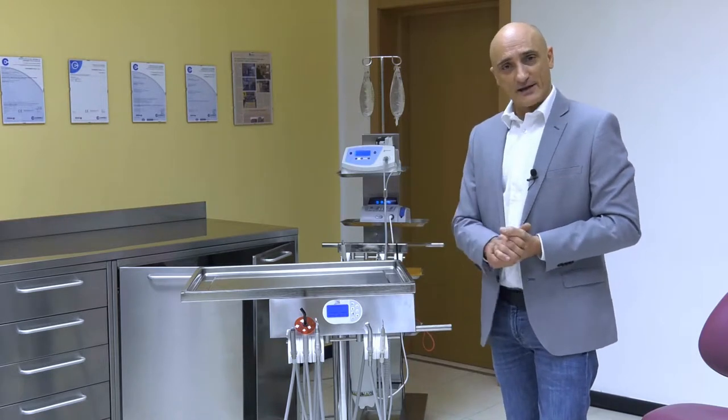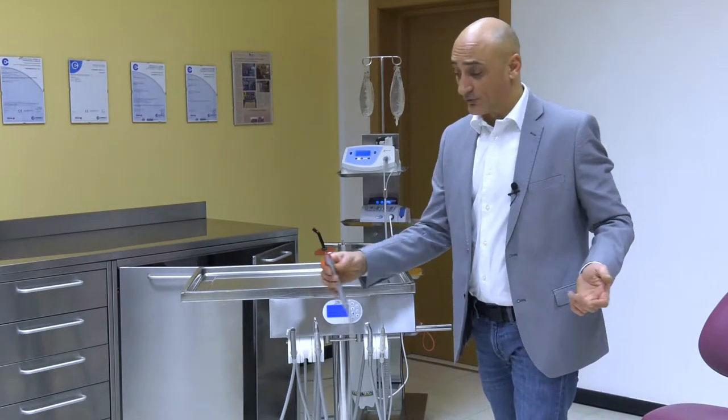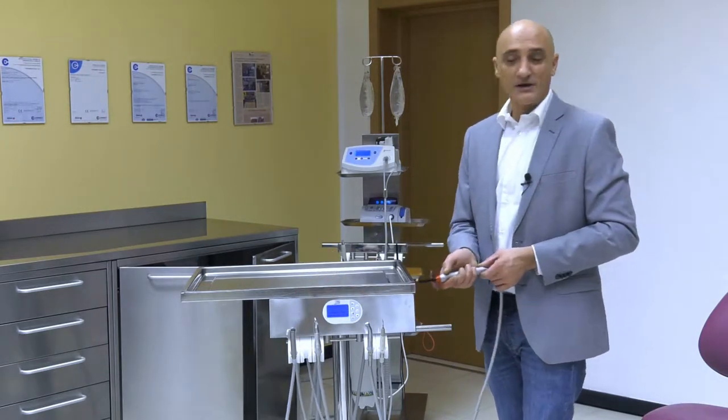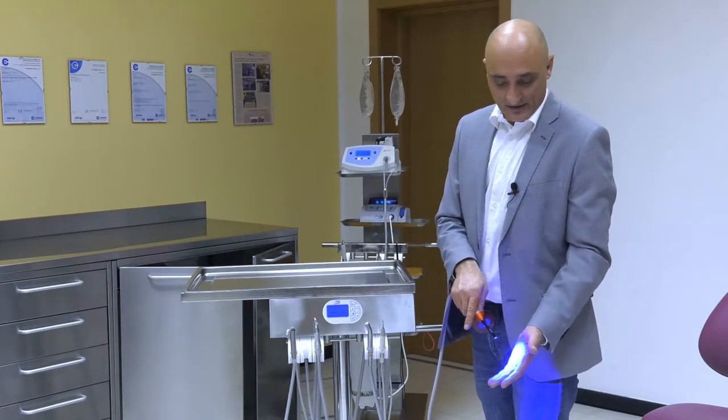How are our instruments engaged? Let us have a look. As regards the photopolymer lamp, just lift it and press the small button, then simply turn on the photopolymer lamp.